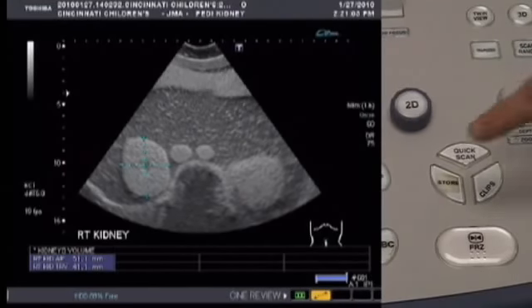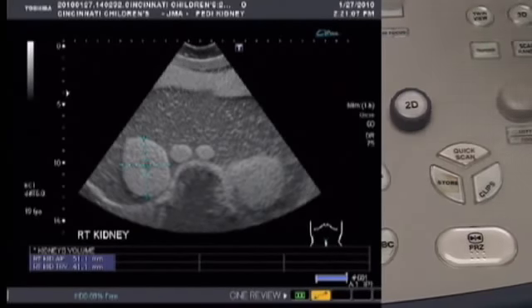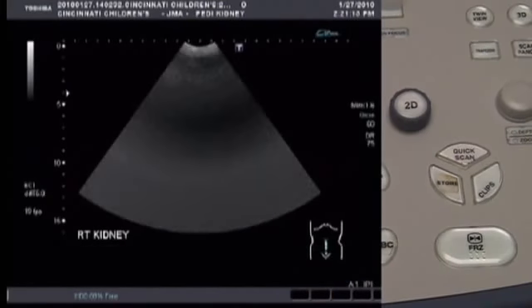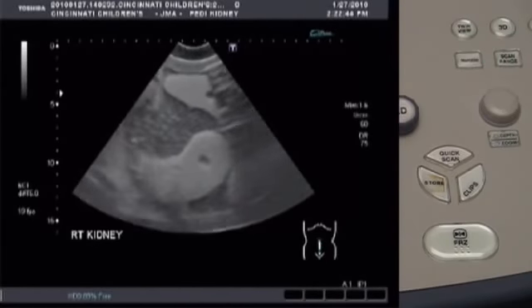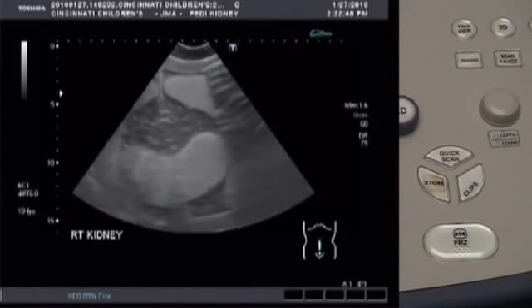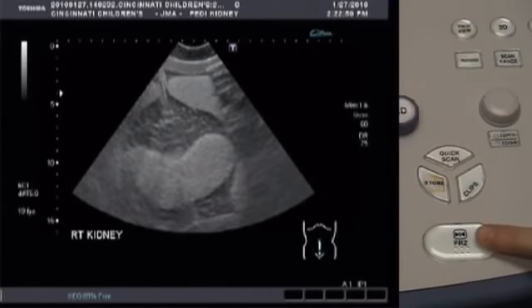If you want to save this image, press Store. But if you just want to get the volume without saving this image, press freeze to release the image on screen. Now scan the phantom in the longitudinal axis until you have a good view of the kidney. Then freeze the image by pressing FRZ.